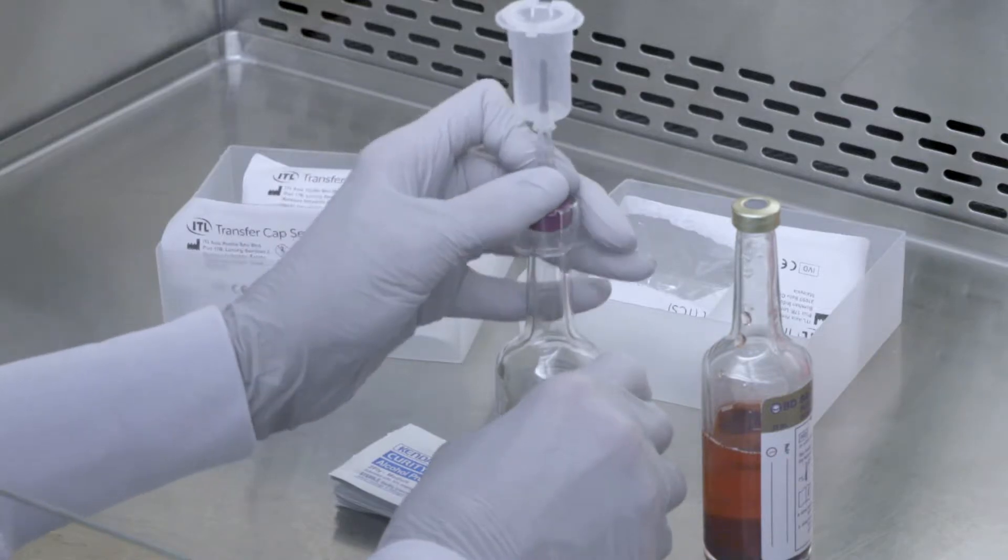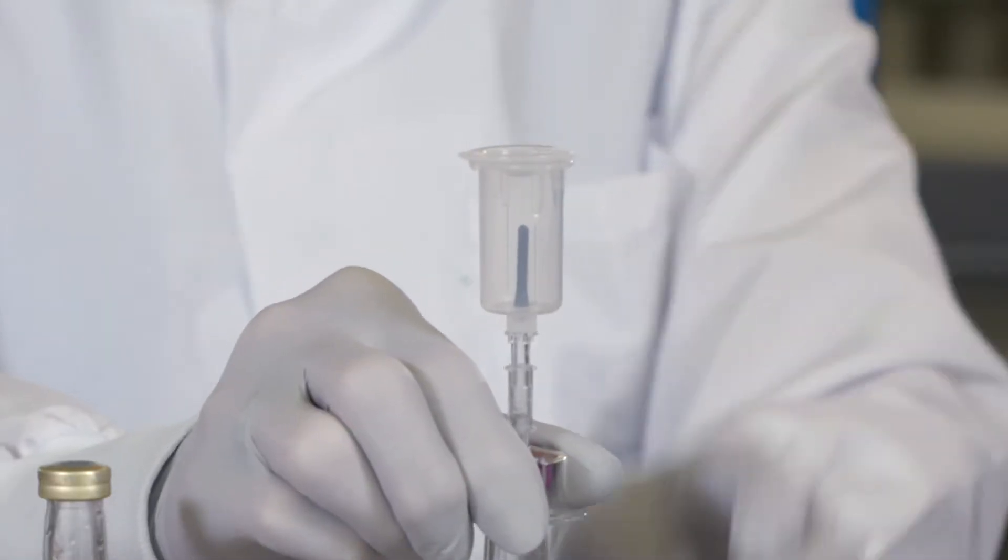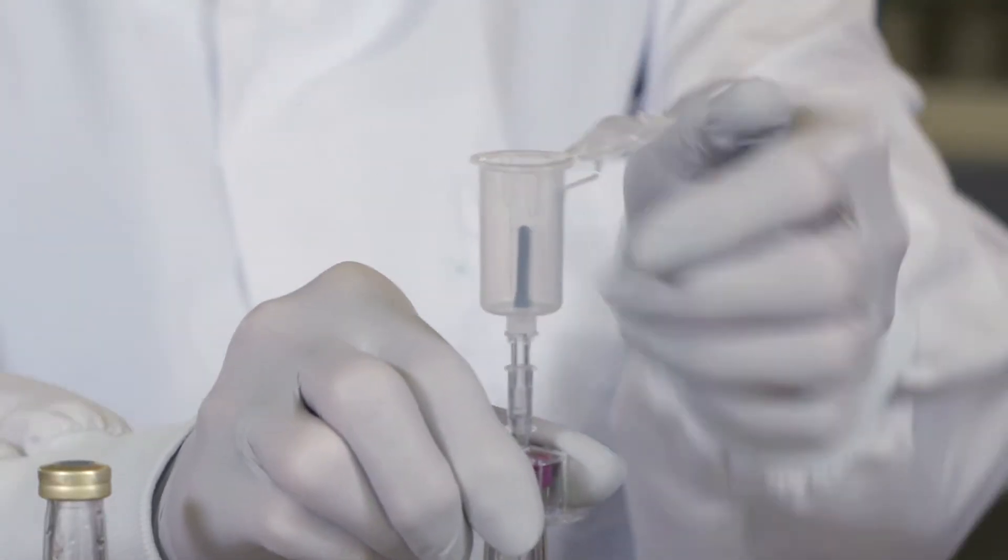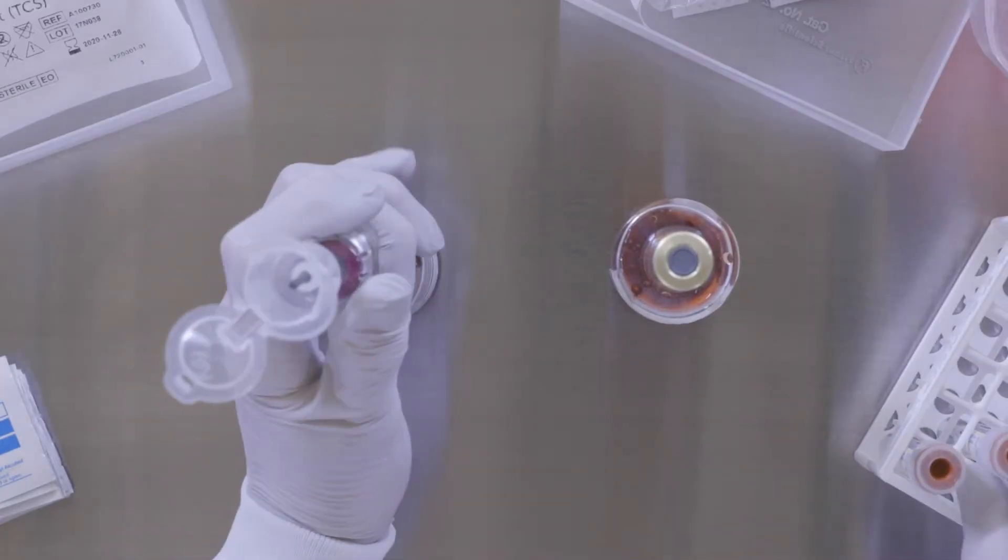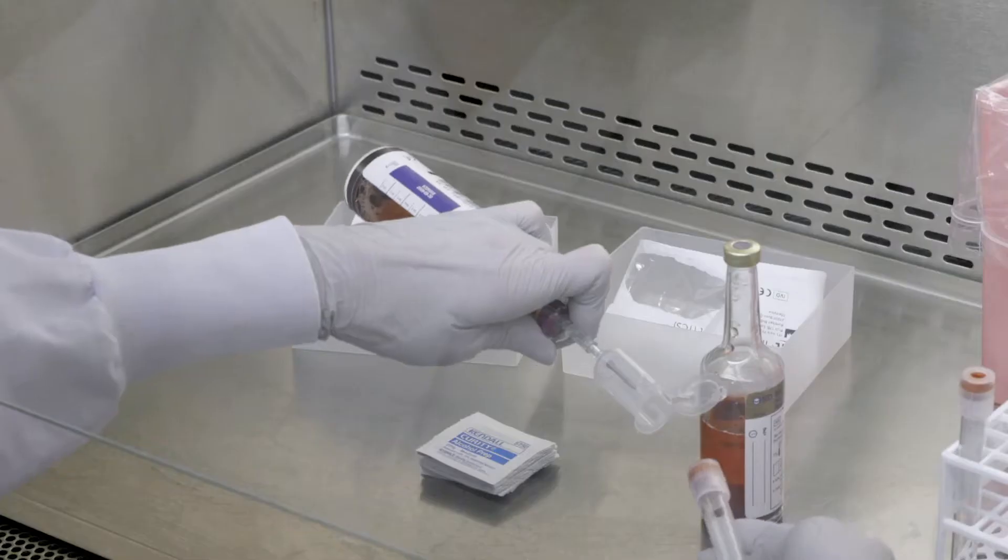Once the transfer capset tip is inserted into the culture bottle, open the safety lid on the tube holder end. Tilt the culture bottle so that the tube holder is now pointing downward.